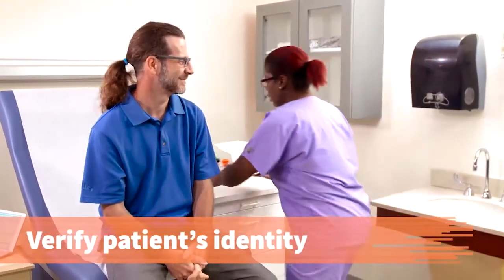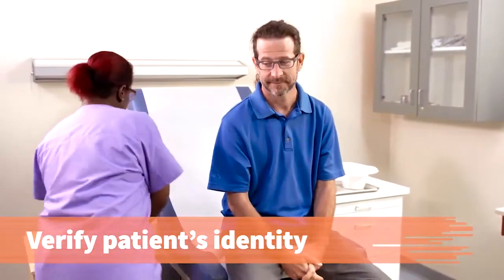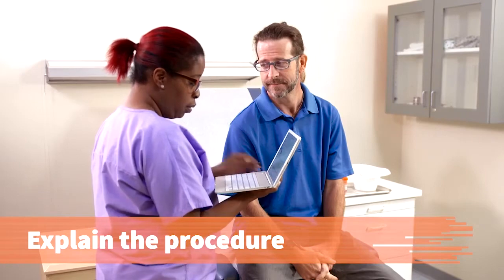Verify the patient's identity with his full name and ask the patient to spell his last name. Then ask for his date of birth. If you can please give me your full name, Jeff Leanhouse, and your date of birth. Explain the procedure to be performed in a manner the patient can understand.